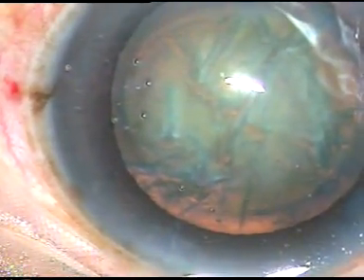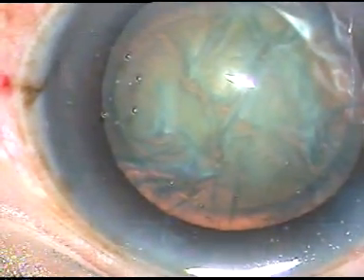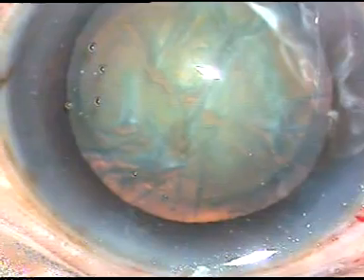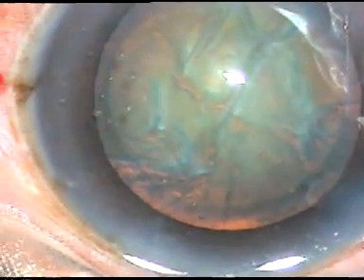Viscoelastic substance is injected again. If you emulsify the nuclear fragments in the back or at the iris plane, there is no damage to the corneal endothelium. This viscoelastic substance is enough.